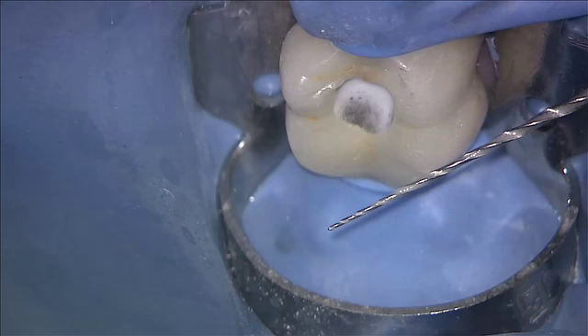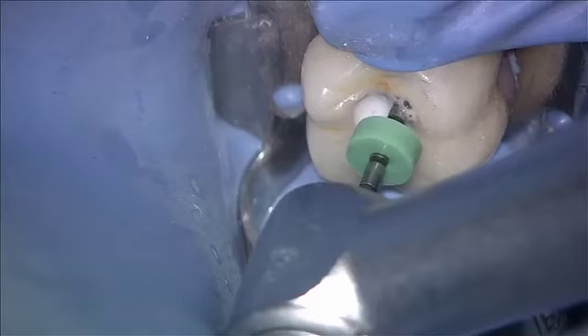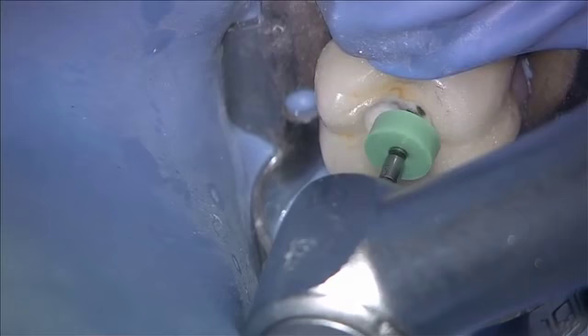That was the 1504. You're going to use both of these at a very low torque setting. Having a 1504 to length should allow the 1506 there. I like this file because it's very, very sharp, but the tip is so small that it's flexible and less likely to transport.